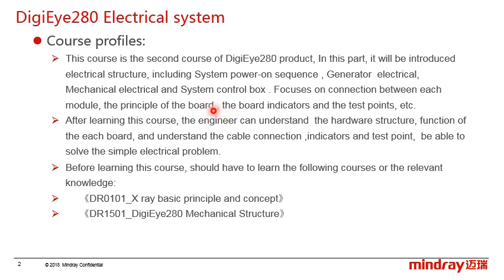And we will focus on the connection between each module, the principle of the board indicators, and the test point, and so on. After this course, the engineer should understand the hardware structure, the function of each board, and understand the cable connection, indicators, and the test point.